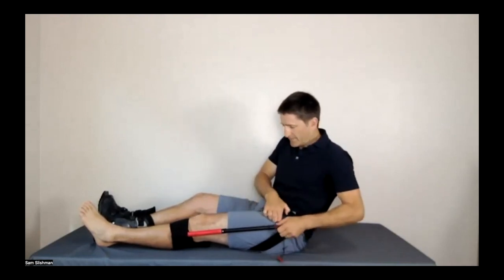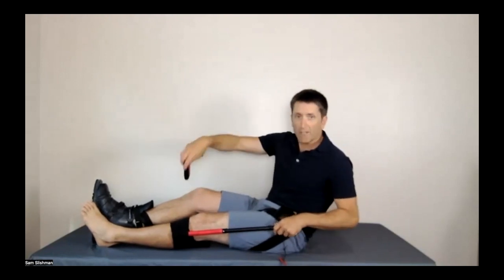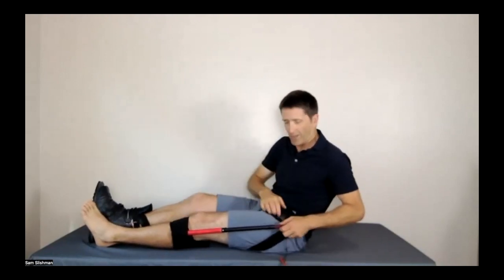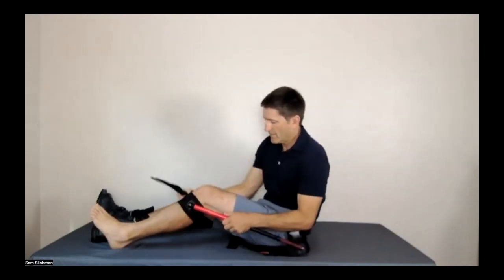And that's it. And it has a black pressure wrap that you can use for bleeding control, but you can also wrap around the feet for rotational stability. Put these in the pile. And now I'm going to go back to sharing.